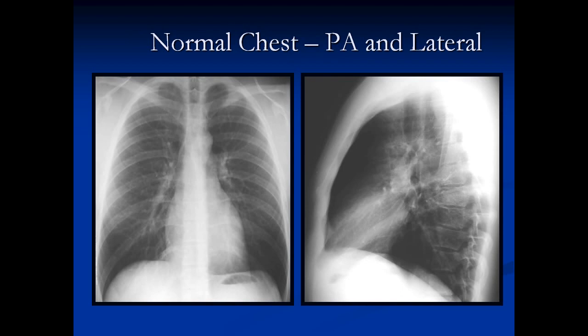We're going to talk a little bit about the normal chest x-ray. These are the normal chest x-rays on this patient, and you can see that they're good quality. You can see the vessels almost everywhere, right in the midline. You can see the spine — the white part — all the way through, and you can see the black airway. We're going to talk about a few of these structures on the next couple of films.